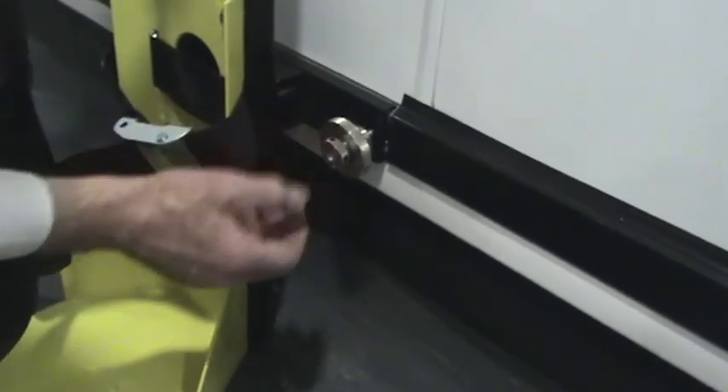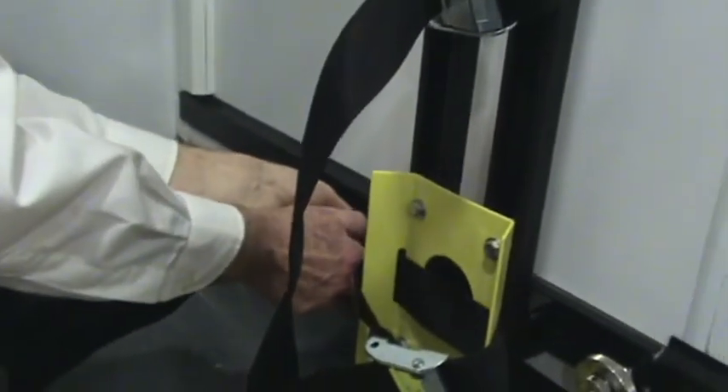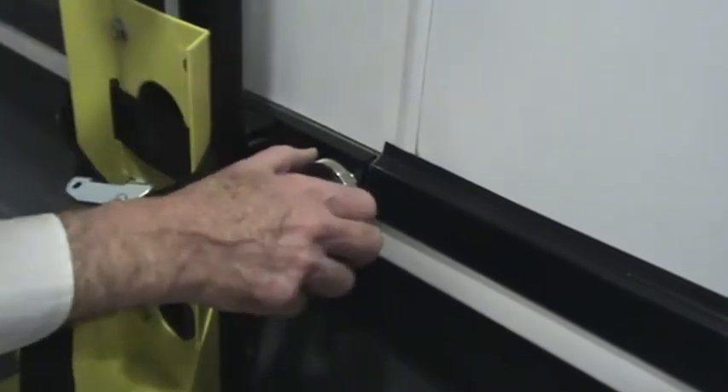You can kind of feel it in position. Same thing over on this side — push in, rotate 90 degrees, and tighten the lock wheel. The holder is installed.